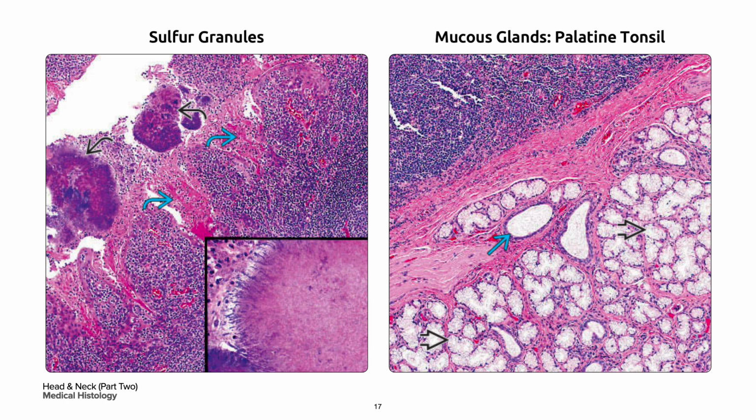On your left are tonsil crypts. They are blind ending and typically accumulate luminal debris such as desquamated keratin in curved blue arrow and aggregates of oral bacteria in curved black arrow. This is likely contributing to the development of chronic tonsillitis clinically. The inset demonstrates a sulfur granule composed of numerous actinomycotic organisms mixed with the other oral flora.